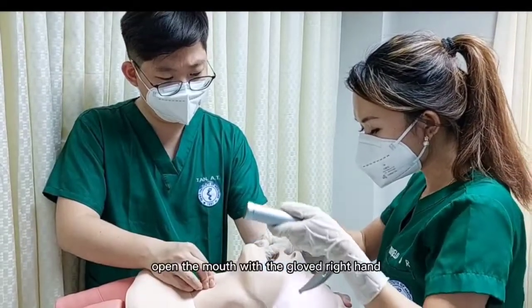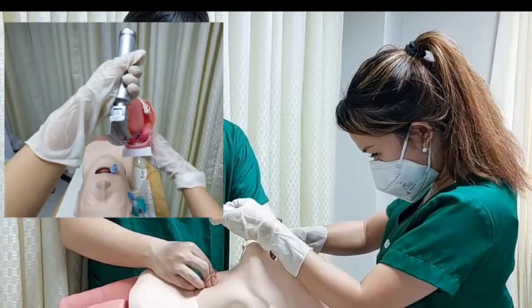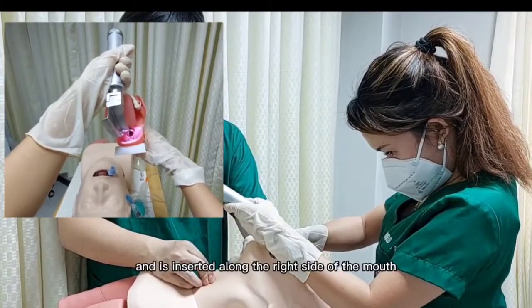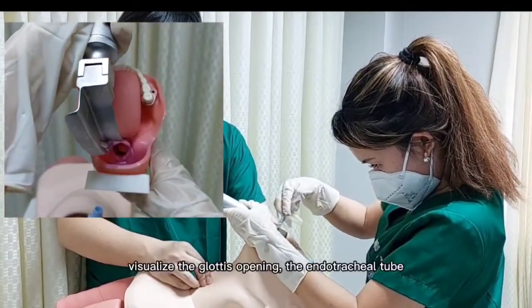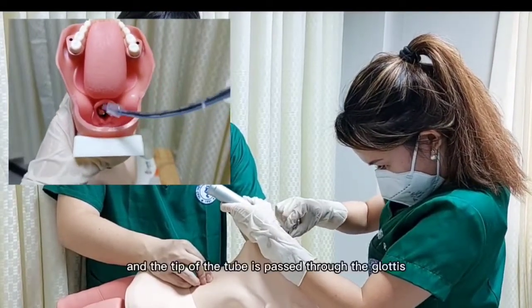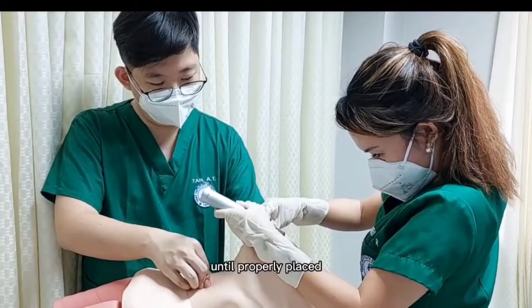Open the mouth with the gloved right hand, scissoring 2 fingers by placing the thumb on the lower jaw and the index finger on the upper jaw. The laryngoscope is held on the left hand and is inserted along the right side of the mouth, pushing the tongue to the left. Visualize the glottis opening. The endotracheal tube is then passed at the right corner of the mouth, and the tip of the tube is passed through the glottis opening and is advanced by 2 cm until properly placed.